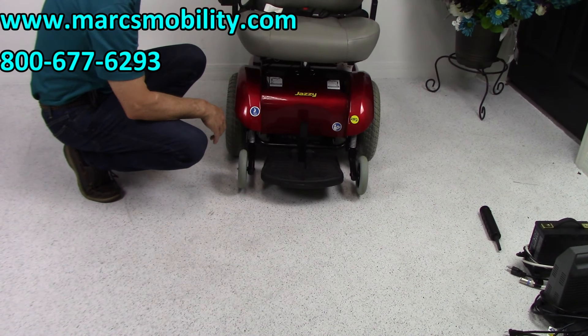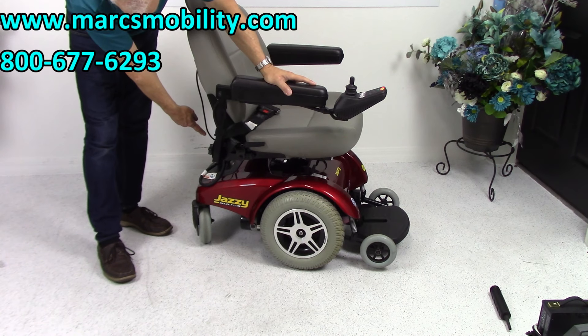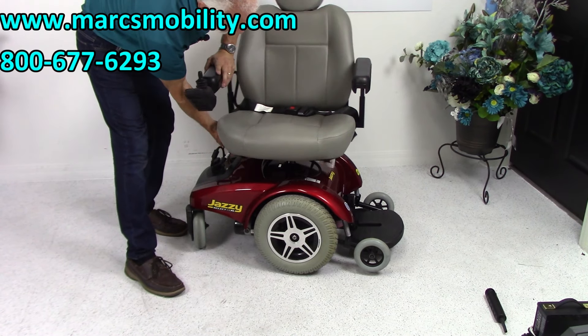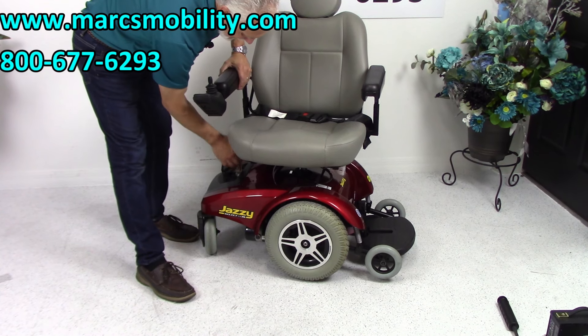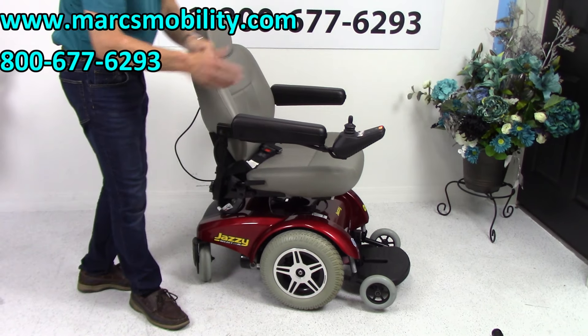This is a swivel seat on this chair. You just have to be careful when you swivel — there are a lot of cables, so the seat would not go all the way around, only to a certain point. If you exit this way, there's nothing blocking you. There's a lever right here, and when you get to a certain point, it'll lock.